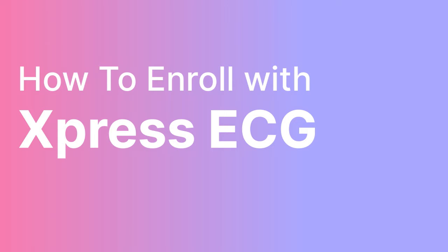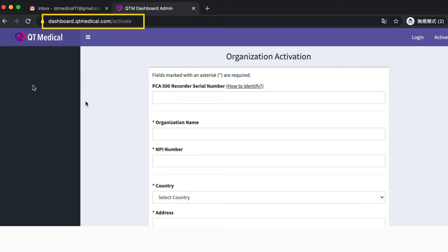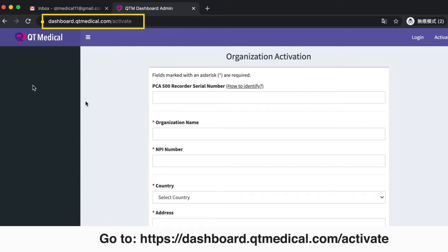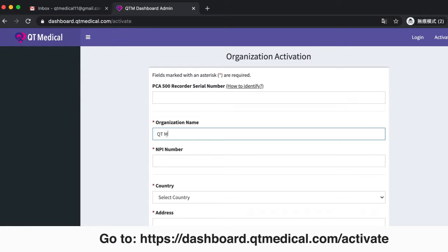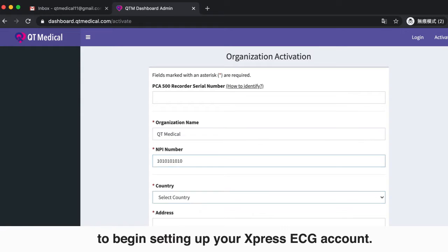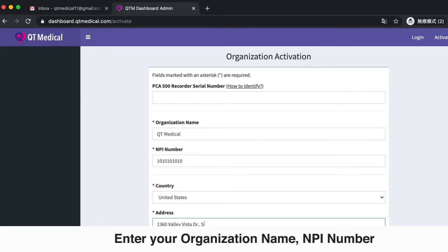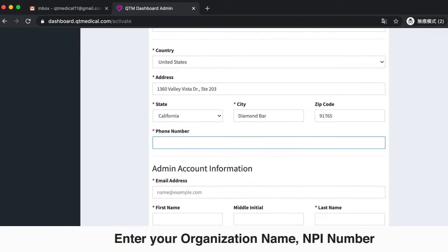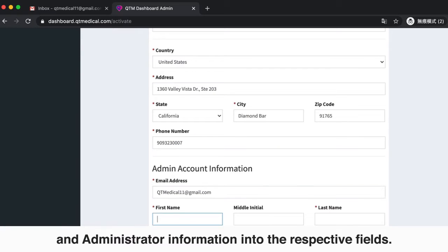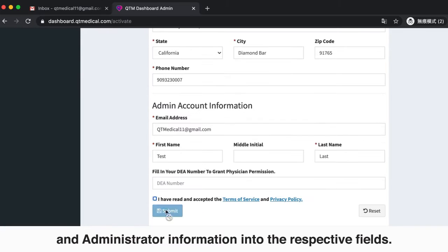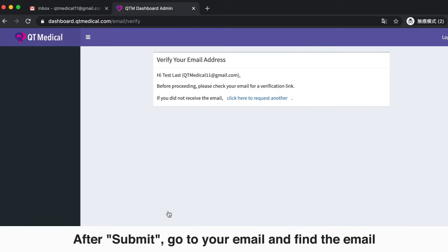This video shows you how to enroll with Express ECG. Go to dashboard.qtmedical.com/activate to begin setting up your Express ECG account. Enter your organization name, NPI number, and administrator information into the respective fields.